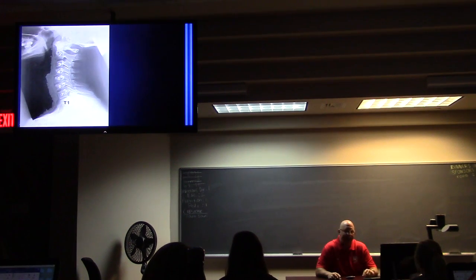We're also looking at what's called the anterior vertebral line, and that's right here. Follow my mouse here. The front of their vertebral bodies. It's just a nice, smooth, arcing line like that. That should not be disrupted. Then we're looking at the posterior vertebral line. That's the back of the vertebral bodies. It's a nice, smooth, sloping line. That should not be disrupted. Then we're going to look at the spinolaminar line, and that's this. See where the spinous processes have a little white stripe? You line all those up, and that should be a nice, smooth, swooping line. That should not be interrupted or disrupted.